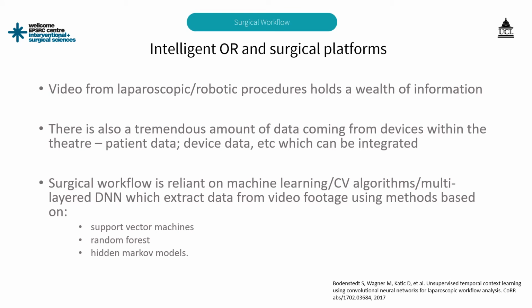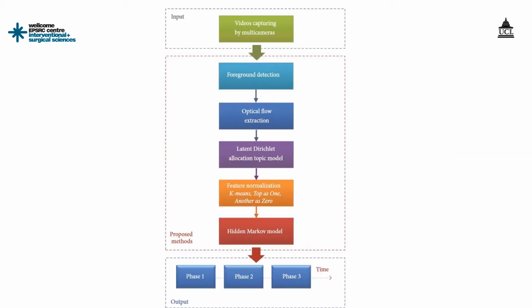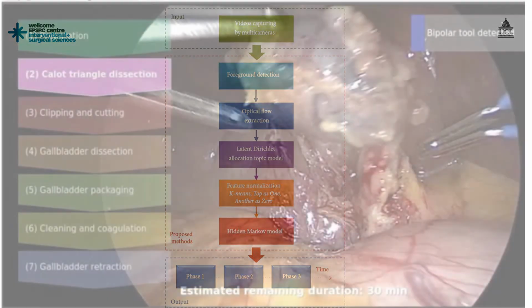the surgery. So can we use the same sort of information and the same techniques in surgery? Well, of course we can, because we're getting video feed from the laparoscopic or the robotic endoscope, and it holds lots of data. Again, this is more of a technical slide, but this is essentially how the engineers and the computer scientists try and build out that data. And it's easier to see when we show you the kind of steps in surgical procedures.